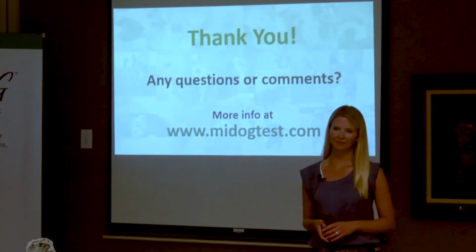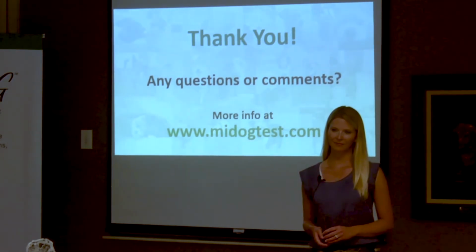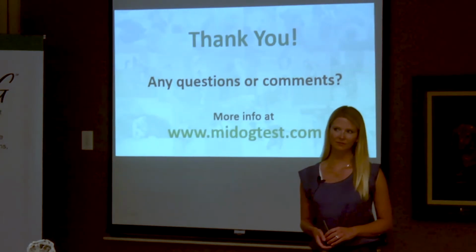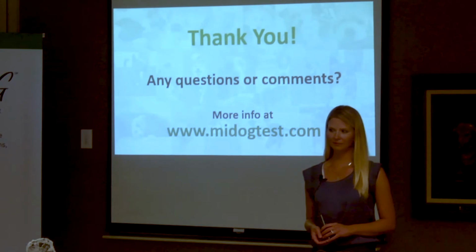Yeah. I used to work for Immunex. They had bought one of the first PCR sequencers right when I left. I was like, okay, I don't have to do that anymore. But oh well. Yeah. So basically, you can quantify the microbes by how many cycles you need to reach a certain signal. Okay, got it. You're cycling.